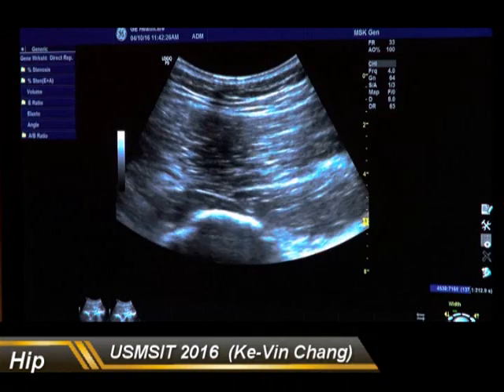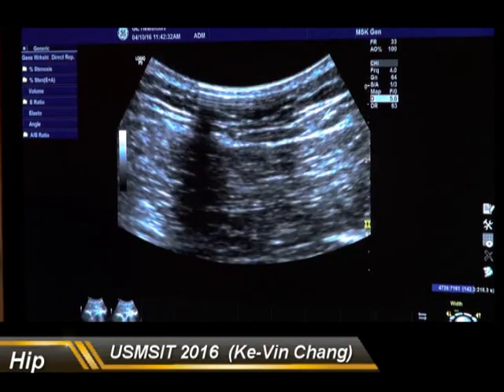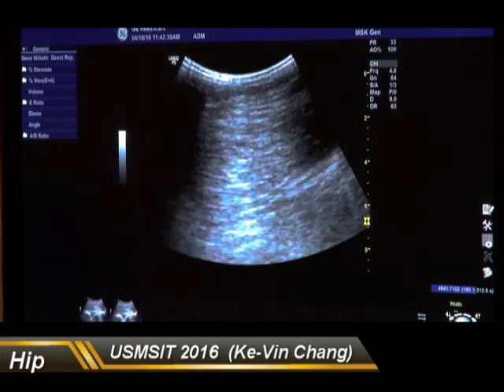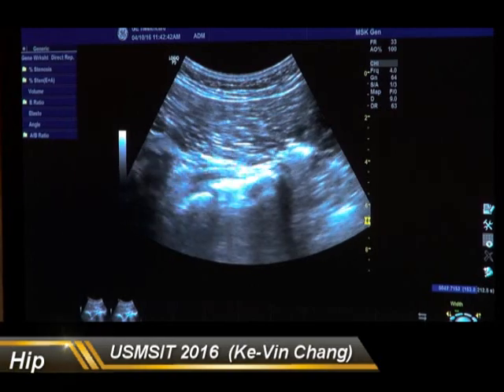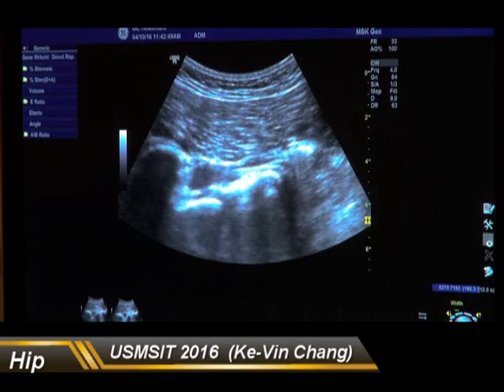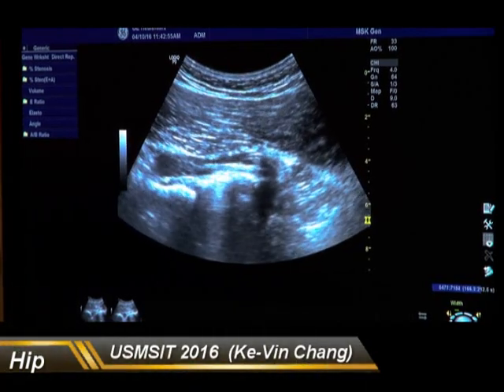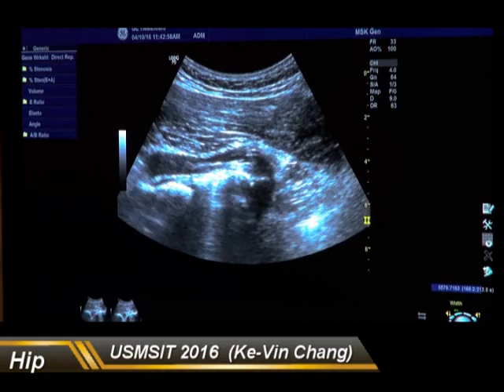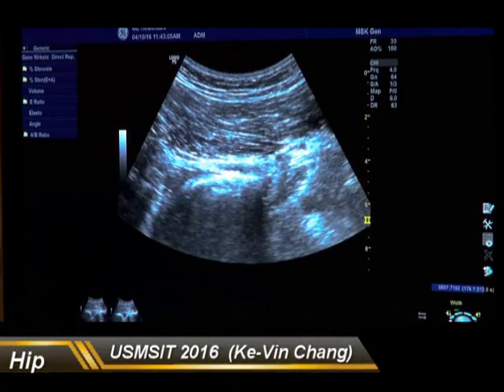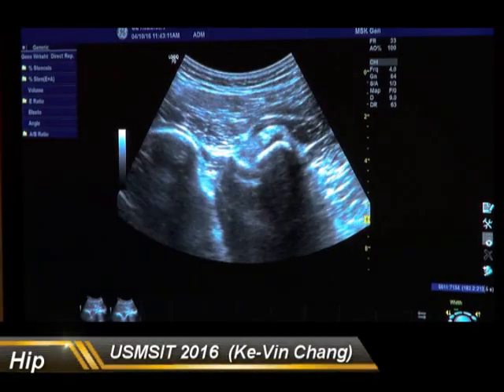We are going to see the ischium, the femoral head, and femoral neck, and then the greater sciatic notch. We can do internal and external rotation to see the movement of the piriformis. Moving the probe more distally, you are going to see several small rotators. For example, this is the obturator internus — we can do dynamic tracking because you can see the muscle coming from the posterior side of the obturator membrane. And this is the superior gemellus, inferior gemellus, and the quadratus femoris over here.